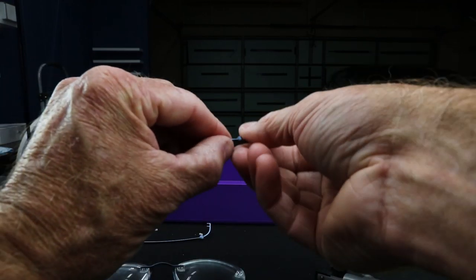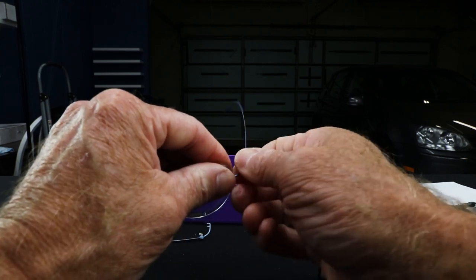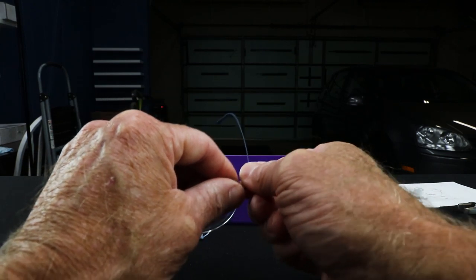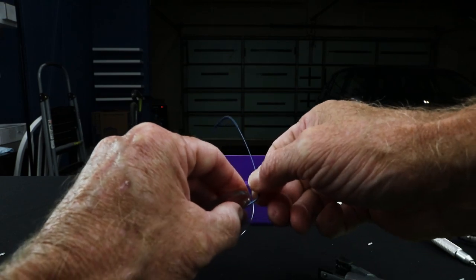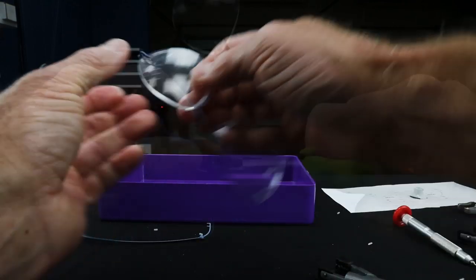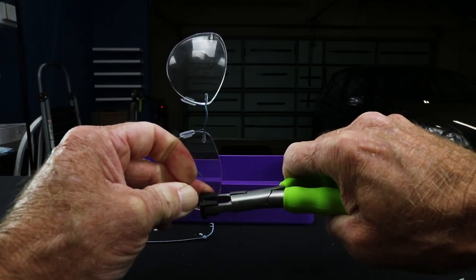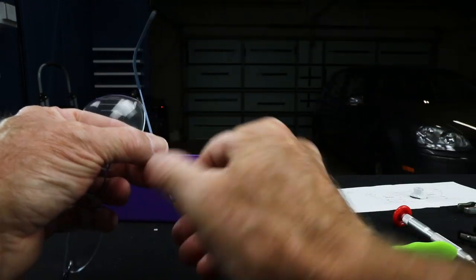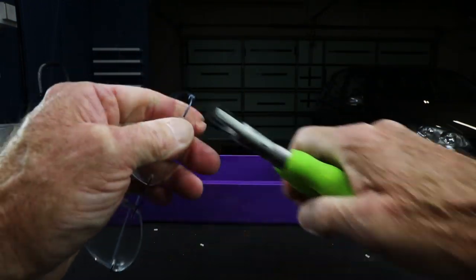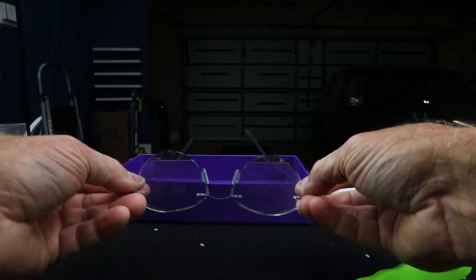Always make sure you've got the right temple on the right side and the left temple on the left side. Easy mistake to make, so don't feel bad. Get it started by hand — pushing from the back so the bushing doesn't want to push back through. Set that one, and we've got one to go. I'll do a little bench alignment on that and take a fashion shoot for you.